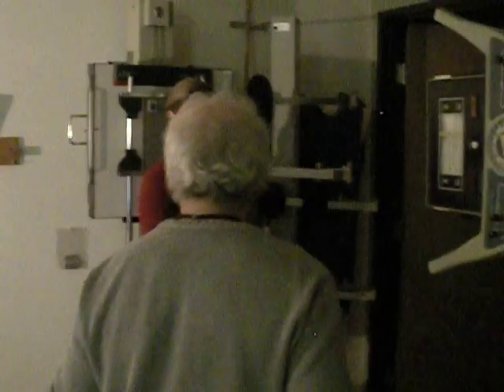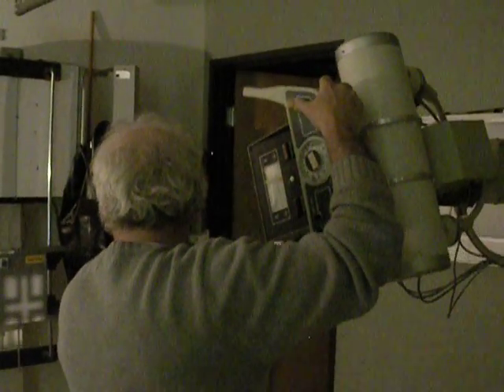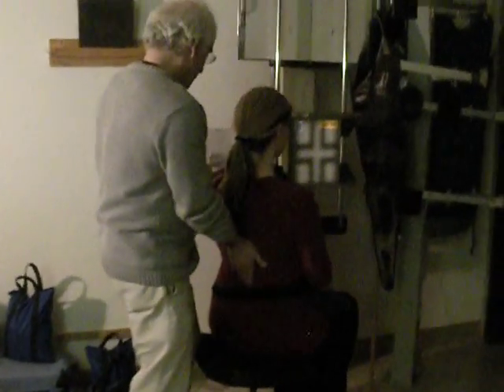That's that. Thanks. And now while we're here, I think we're just going to do these oblique views. Why don't you step out for just a moment? Come hither. And swing around there. And sit up real straight.